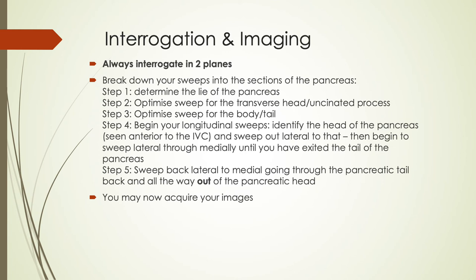Whenever scanning any organ, we need to be sweeping in two planes. In transverse, I break up the pancreas into different areas — first scanning through the uncinate process, the head, and the neck, then looking at the body and the tail. I start superior to the organ and sweep inferiorly. I'll optimize my window for the head, uncinate process, and neck, sweep through twice, then optimize for the pancreatic tail and body, increasing depth, and again sweep from superior to inferior and back.